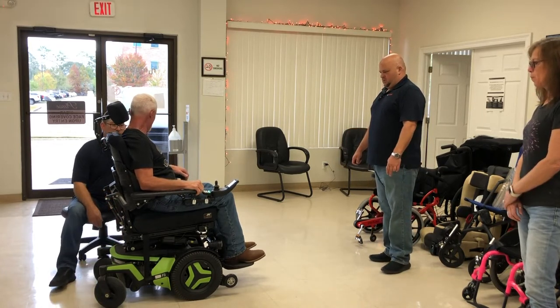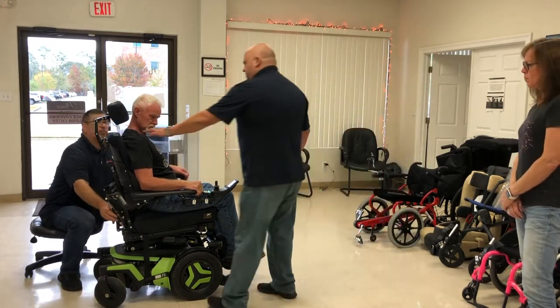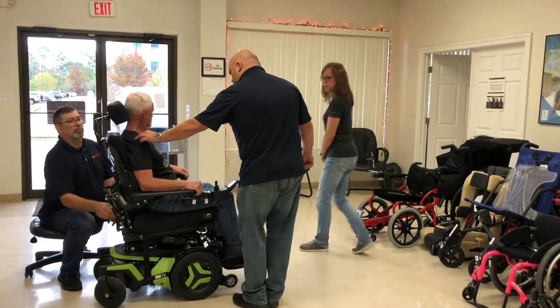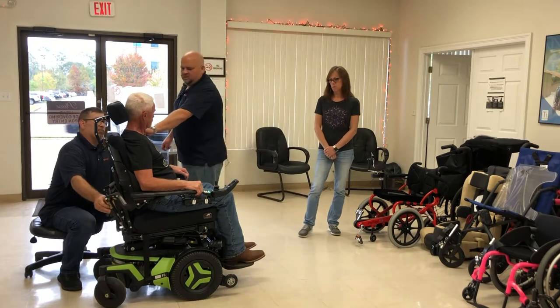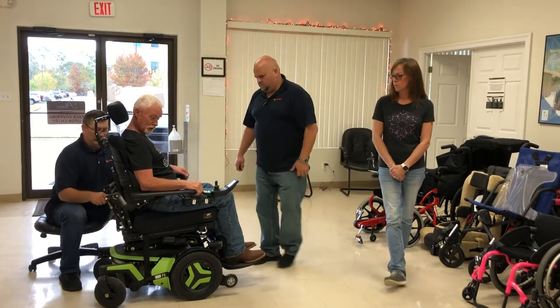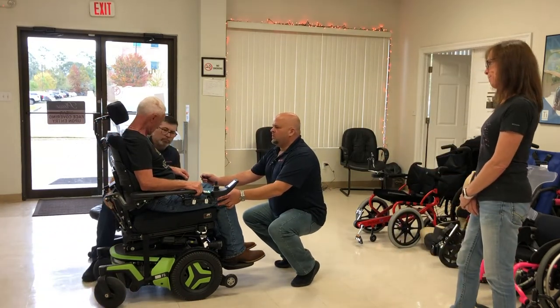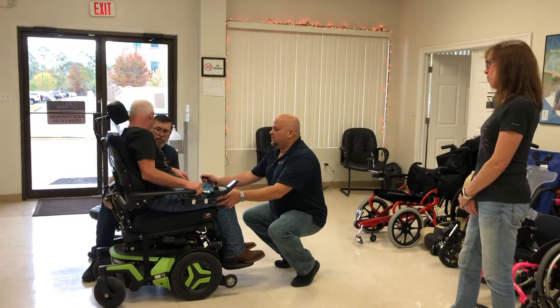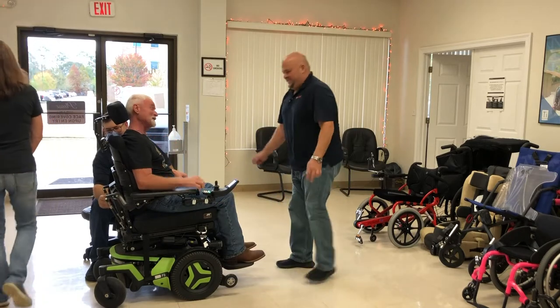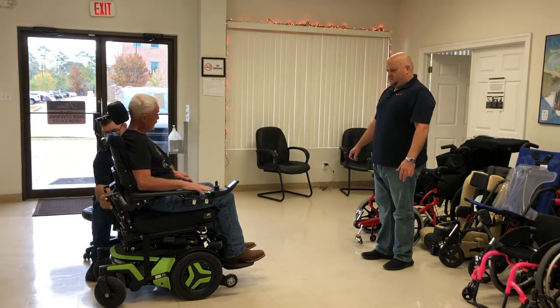We can adjust that for you. How's this shoulder feel right here? I don't see any subluxation or anything. Yeah, this one looks a little elevated, so maybe come down with this one. Over time those things are really important. How's that? Is that better? Yeah, it feels good.